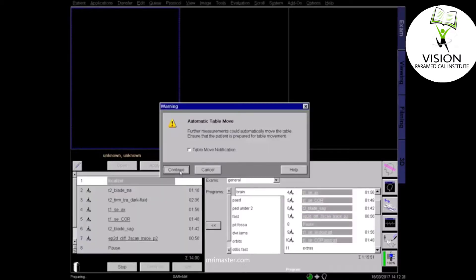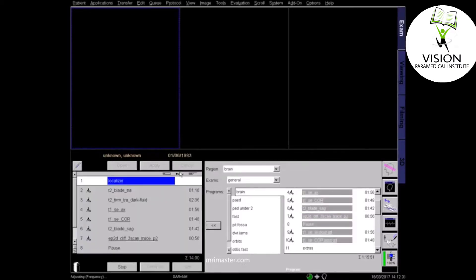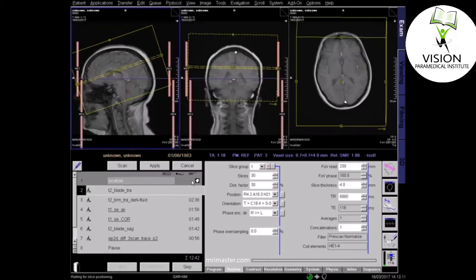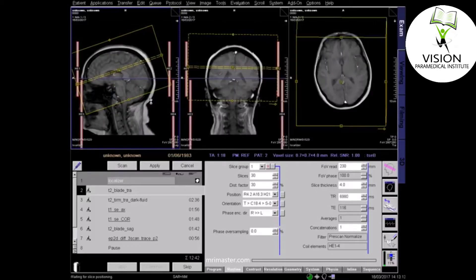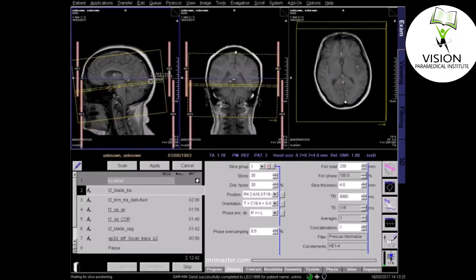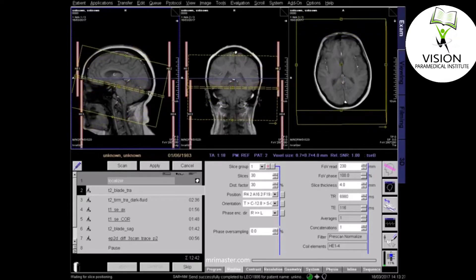Begin with an initial scout or localiser sequence in three planes. Plan your axial sequence in all three planes. On the sagittal localiser, axial slices should pass parallel to a line joining the inferior border of the genu and the splenium of the corpus callosum.